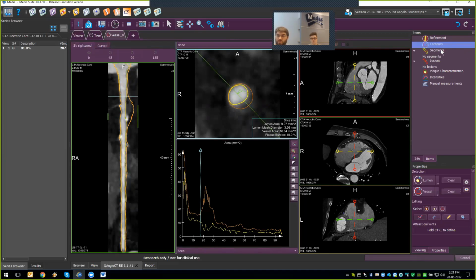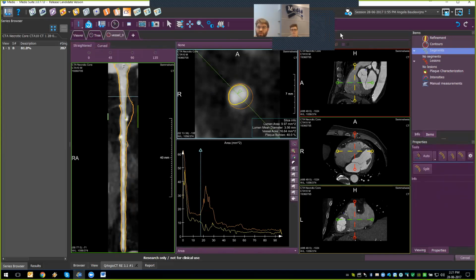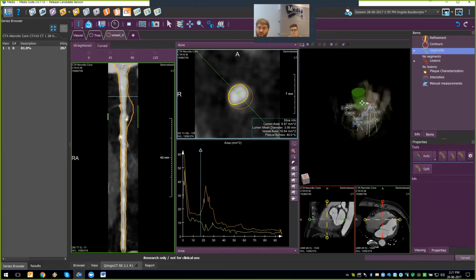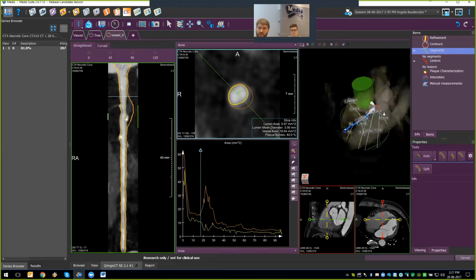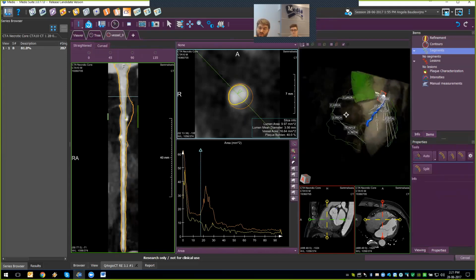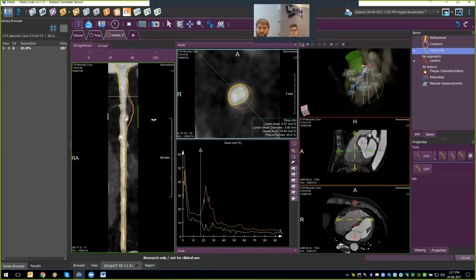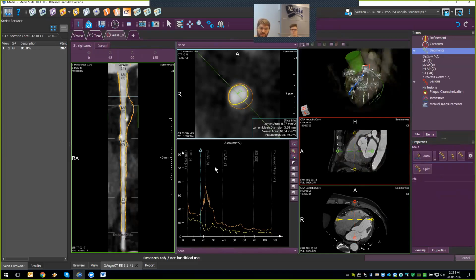Next, we can go down a list and look at the segmental definitions in the vessel. So from the 3D view, we had the anatomical names visible. Can show you that here again. So these names of the vasculature, or the segments of the coronary system, we can apply to this straightened view, and this way we can have sub-statistical analysis in the data.